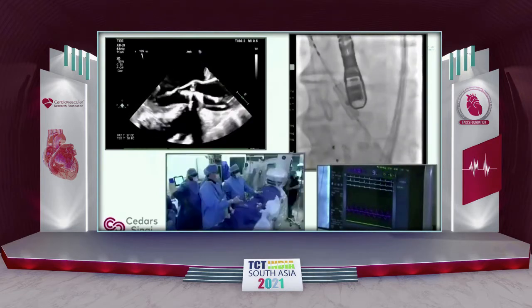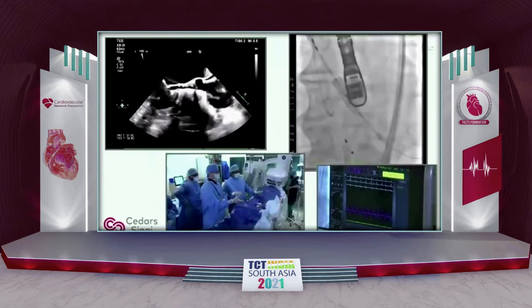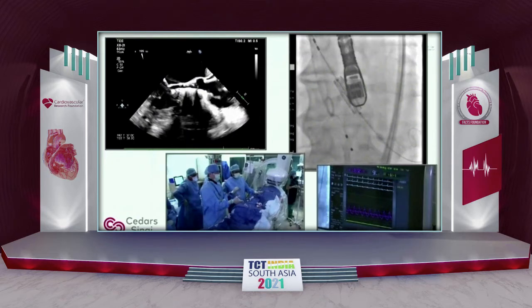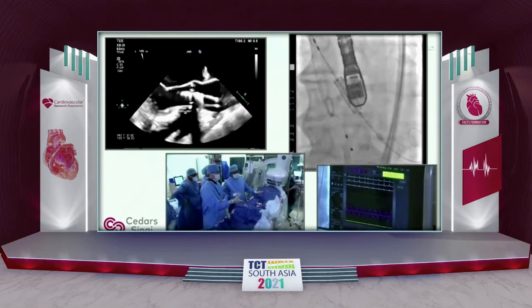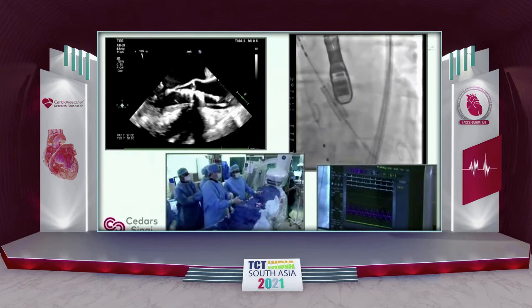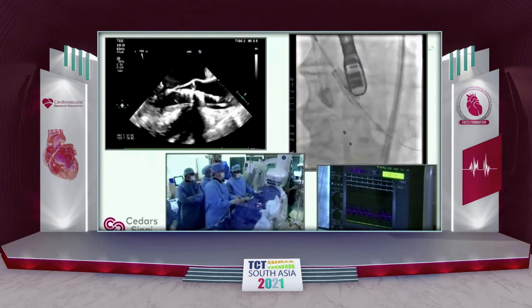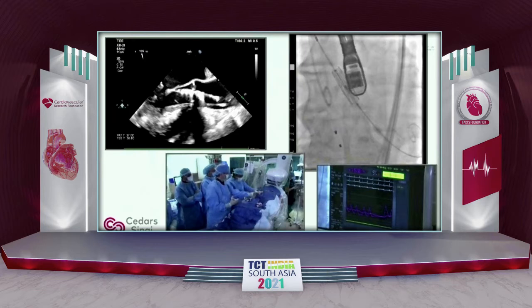I have to say that I had such great reservations about using Lunderquist in the LV, because I thought we were going back to the previous decade of TAVR, in the early days. But I am pleasantly surprised, and the reliability with where it lands with self-expanding is terrific with Evolut. And using rapid pacing, we've actually changed whenever we do self-expanding valves. It's almost like relearning how to use the self-expanding valve. And actually, I have to say the results are much better. I have to completely agree with the champions such as Hemal, who really pushed this.